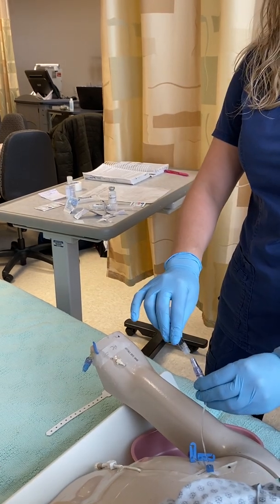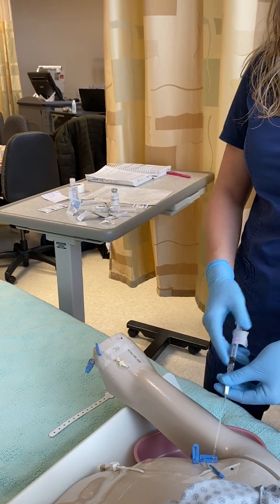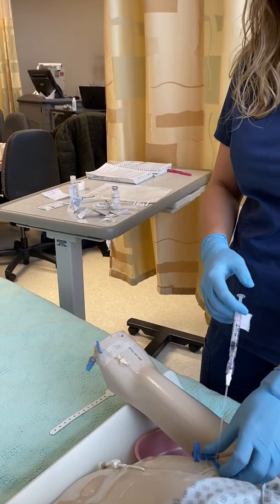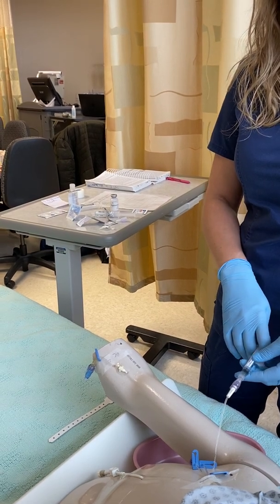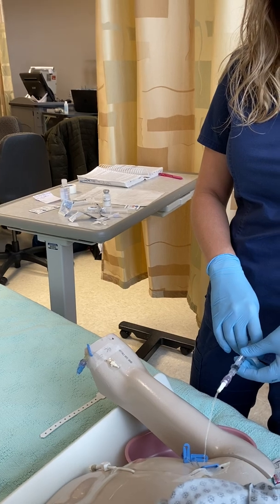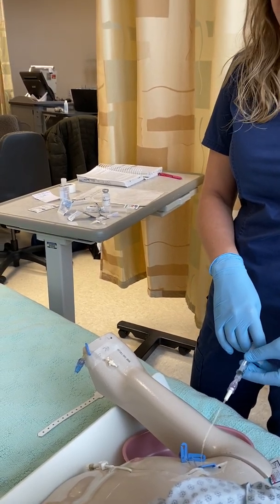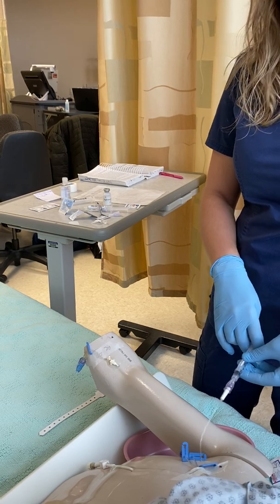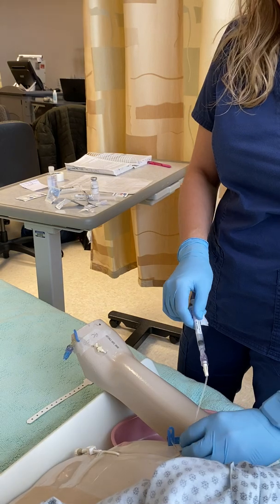We can go ahead and get ready to give our med. So we're going to attach after it's dry. And like I said, we can give the full amount, unclamp, over 2 to 3 minutes undiluted. Making sure not to give it any faster than the 2 to 3 minutes. Looking for adverse reactions. We're going to say we gave it over 2 to 3 minutes due to time.